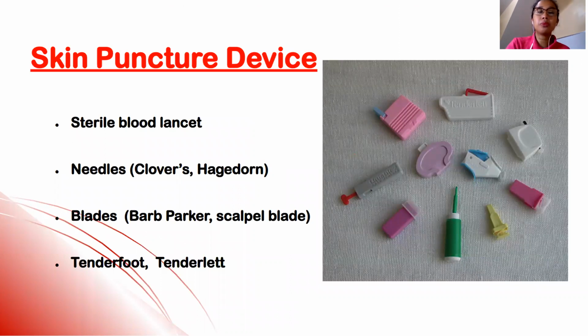So, we could use so many skin puncture. OSHA, CLSI recommend that the lancet should retract. Yan, dapat umaatras yung needle for it to be safe. Yan. So, pagkat press, dapat aatras yung needle para mas maging safe.